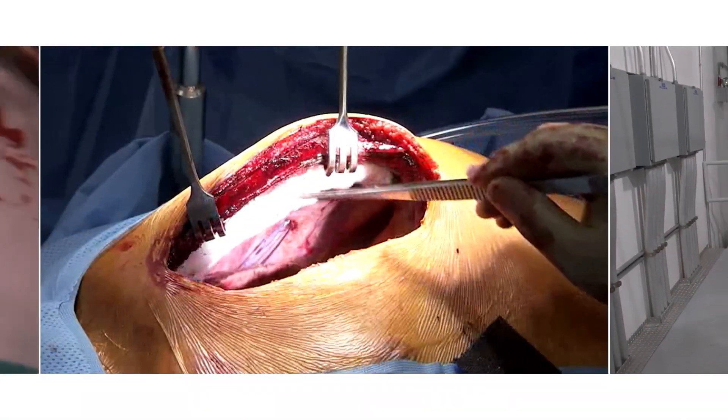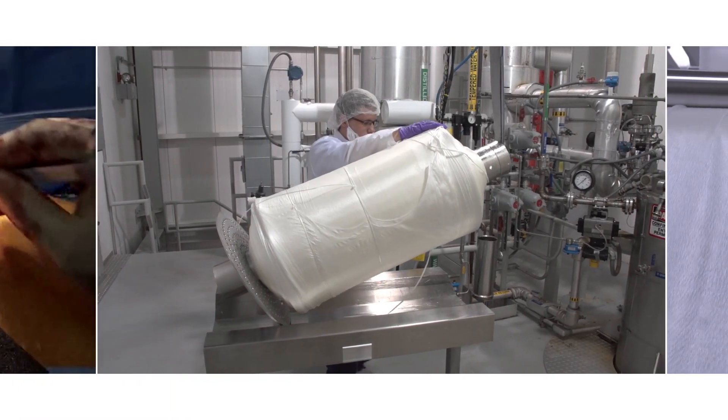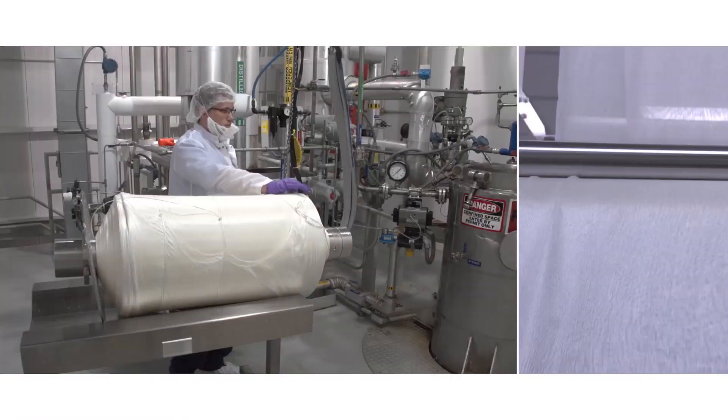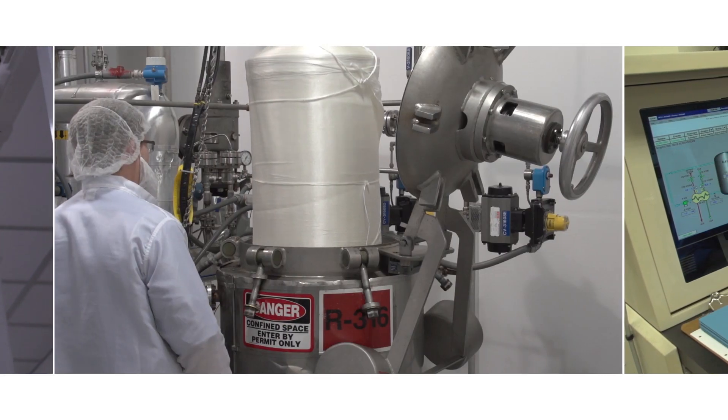Exceptional product quality stems from highly controlled manufacturing and precise oxidation. Our process is unsurpassed from its quality perspective, from our ability to oxidize to the right number.